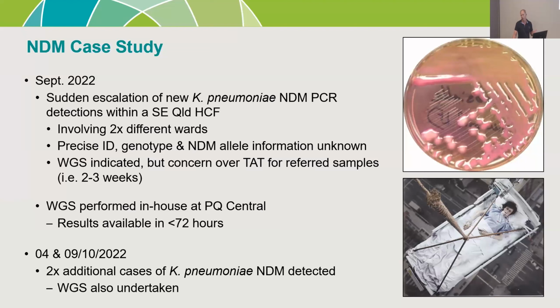Previously, we used to refer these sorts of requests away, but often it would be a 2 to 3 week turnaround time. So we decided, pre-NATA, to actually try and get these results out as quickly as possible. We managed to turn this around in just under 3 days.